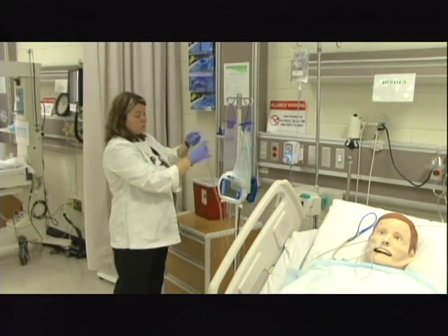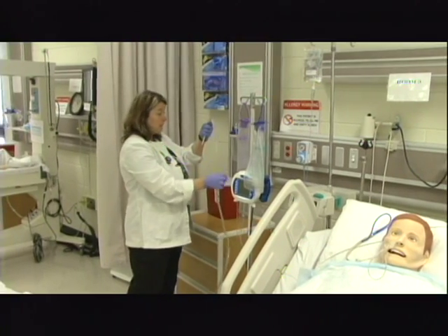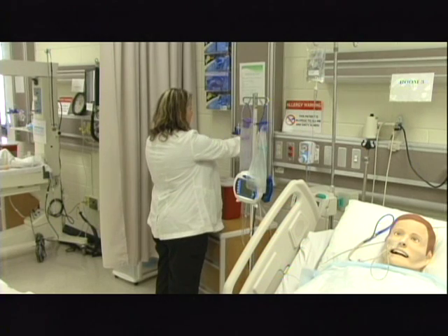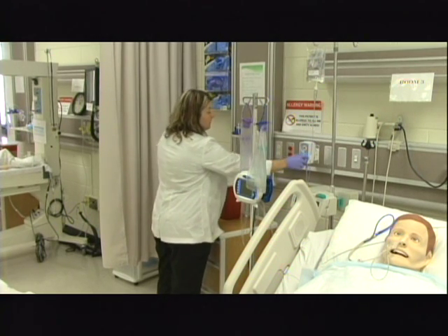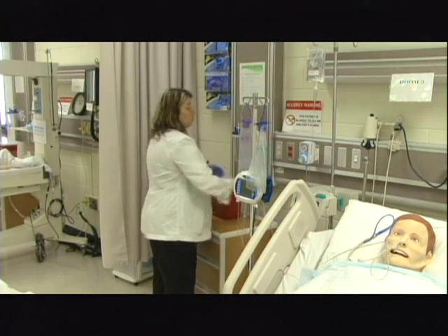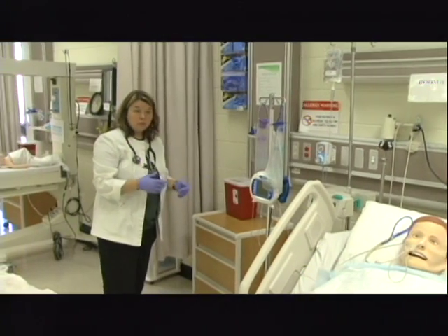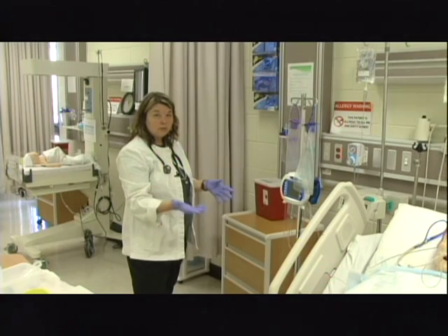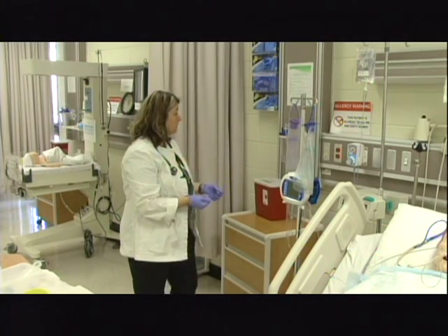Please make sure you've checked your tubing before you do this, because it could leak, and you probably want to suck back up any of the secretions into the canister as you're doing this. I'm going to turn the suction off at this point because, as I said before, you need to leave the patient off of suction for a minimum of 30 to 45 minutes after you give medications, or it'll be suctioned back up in the tubing.